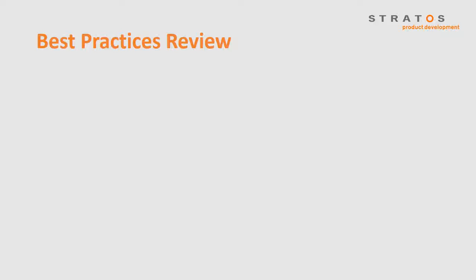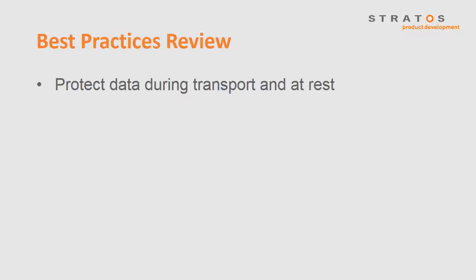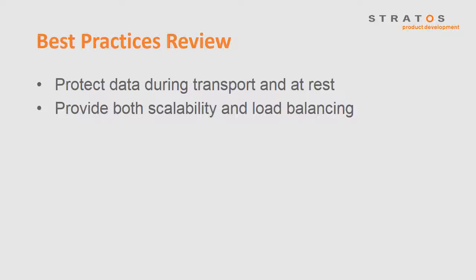Let's look back over some of the best practices that we've talked about today. Remember to protect your data at all times: while moving to the cloud, from the cloud, and while it is in the cloud. Provide scalability and load balancing to keep your system performant. Design for failure. This can take many different forms.